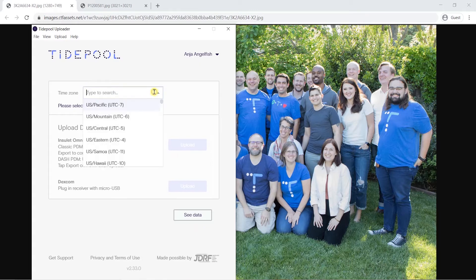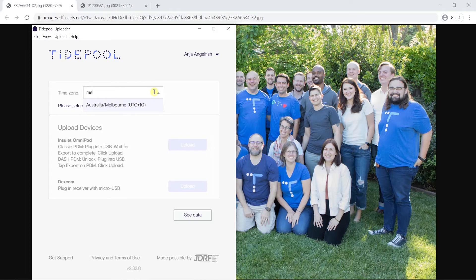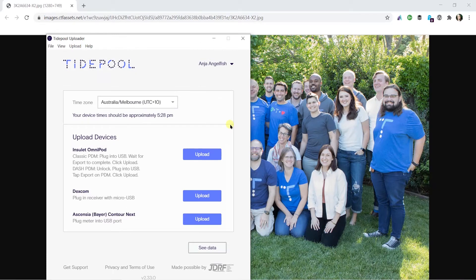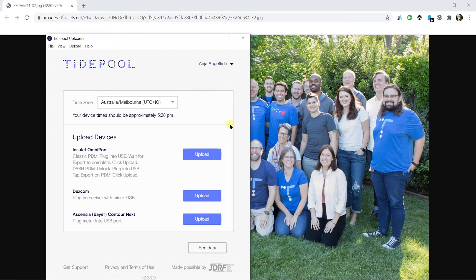Next, you'll need to select your time zone from the drop-down menu in the upper part of the screen. Your time zone is what keeps your data in sync and should match the time on your diabetes devices. You can even use Tidepool Uploader to update your blood glucose meters and CGMs to the right time with each upload.